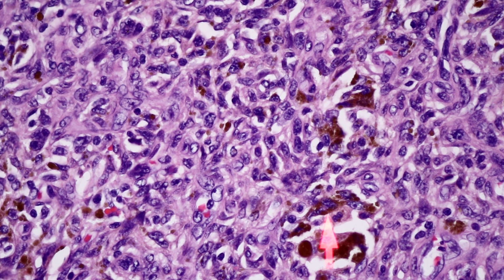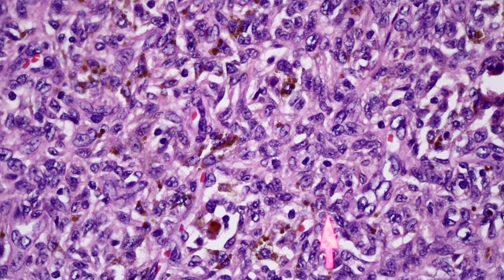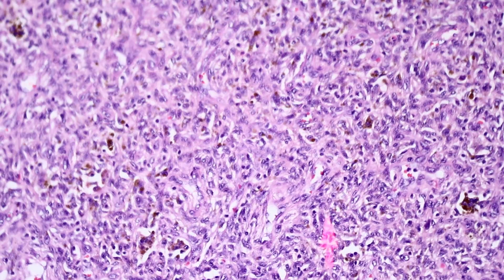I rarely, if ever, have actually seen hemosiderin in DFSP or hemorrhage. And I've seen a lot of DFSP. It's just an extremely uncommon finding in DFSP, but relatively common in dermatofibroma. Okay, so a nice example of the hemosiderin deposition.